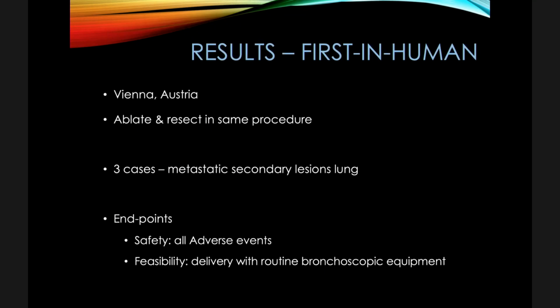The 3 initial in-human studies were completed in Vienna, as I mentioned, and in these, patients underwent ablation and resection within the same anaesthetic procedure. There was one adverse event in this group where a patient underwent a wedge resection which did not contain the tumour. And so for this reason, moving forward into the treat and resect study conducted at Royal Melbourne Hospital, we elected to use lobectomy routinely.